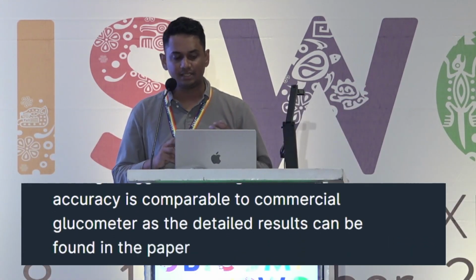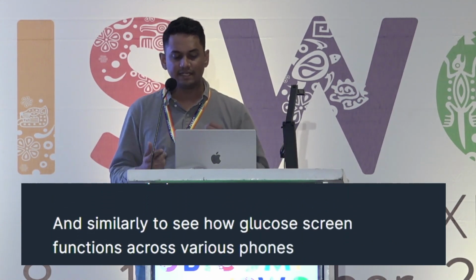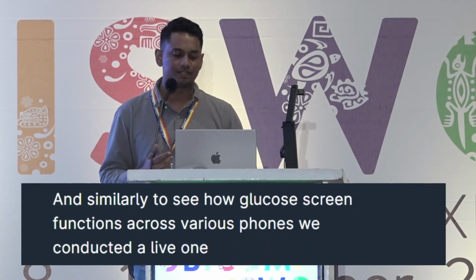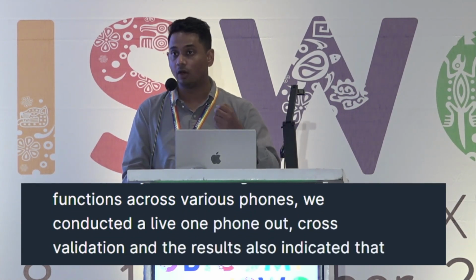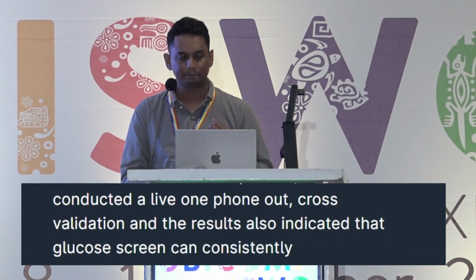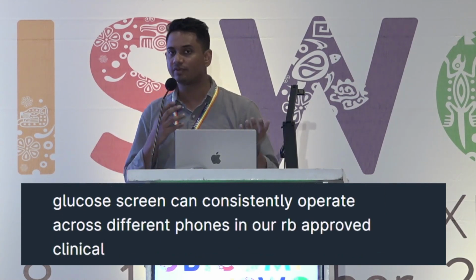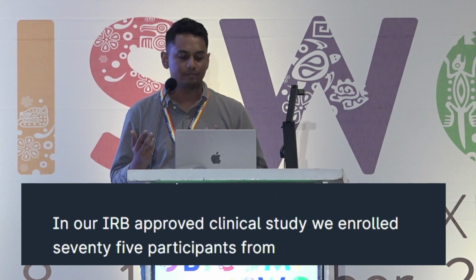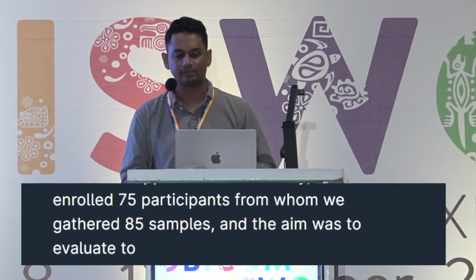Similarly, to see how GlucoScreen functions across various phones, we conducted a leave-one-phone-out cross-validation, and the results also indicated that GlucoScreen can consistently operate across different phones. In our IRB-approved clinical study, we enrolled 75 participants from whom we gathered 85 samples. And the aim was to evaluate how GlucoScreen works with real blood samples.